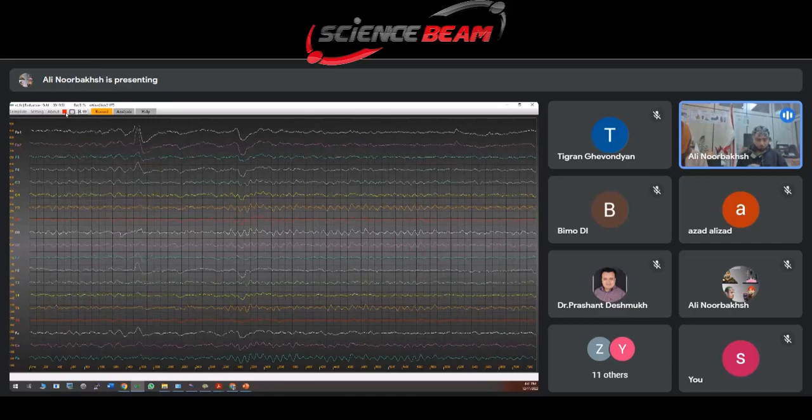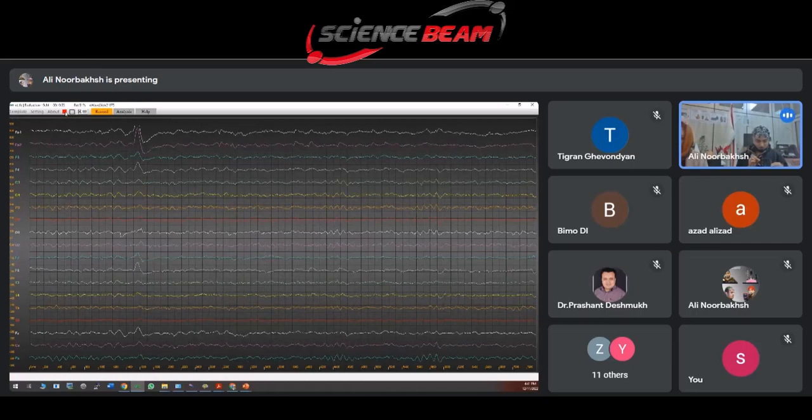After that, we should stop the software and we should record it, okay? Again, we should go to this page, user, and we should add this parameter.